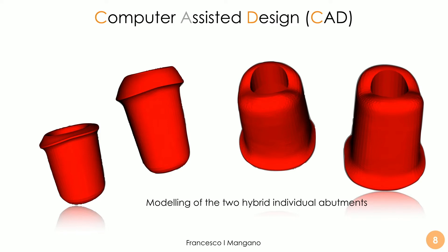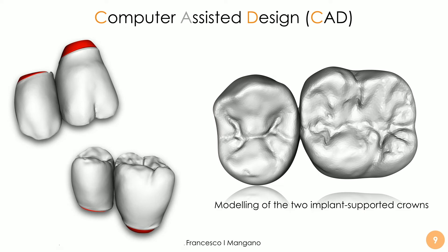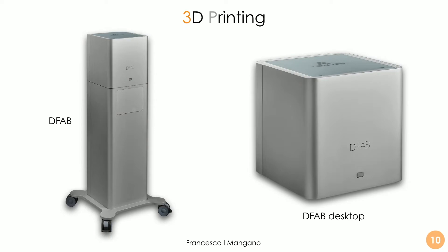In this case, I will show you the application of the same workflow with the DFAB from DWS system — a very powerful, compact desktop machine, incredibly fast, capable of printing hybrid ceramic in a very short time frame with very good results. We can use the modeling of the individual hybrid abutments and the crowns to finalize the whole case using the DFAB in a full in-office workflow, very fast and very predictable. We have two options: the DFAB desktop without the computer — very compact and beautiful to see — and also the version with the computer built in.